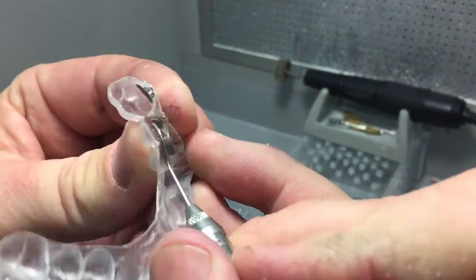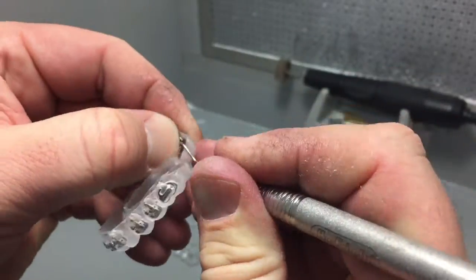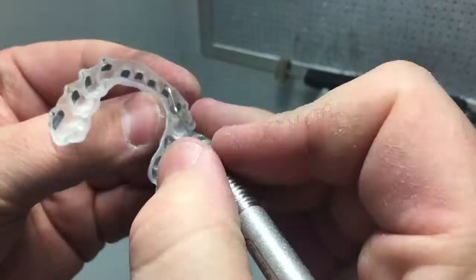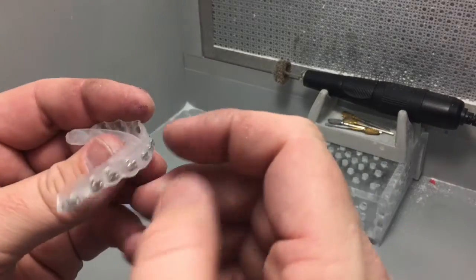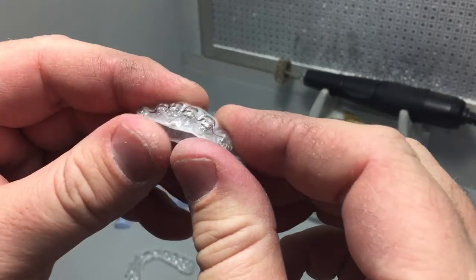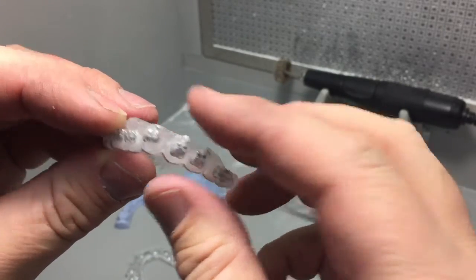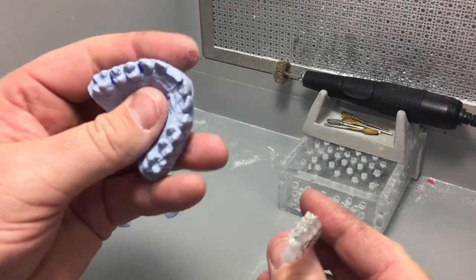There you go. Now they're ready to go back on the models. Here's the outer tray and inner tray. You can see how it just kind of barely cups those brackets, and then back on the model.